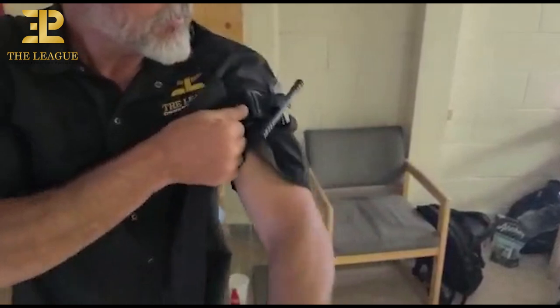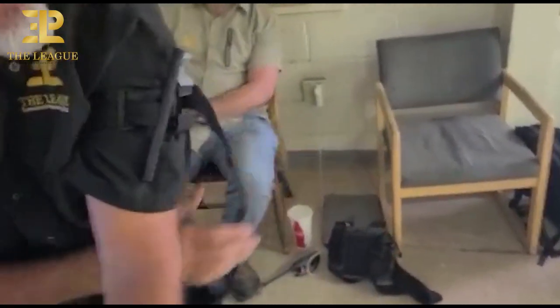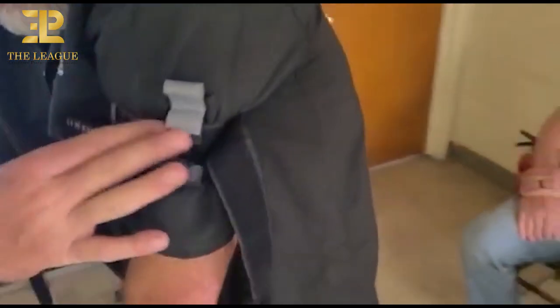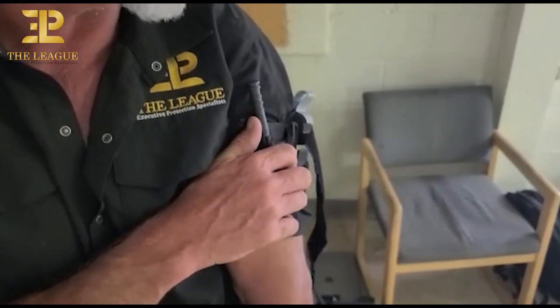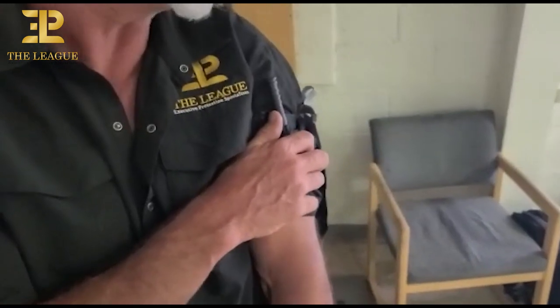Snap. Make this as tight as you can. Now, before you ever touch the windlass — which is the bar — it's generally going to take two and a half to three and a half turns in real life. We're training one to one and a half, whatever you can tolerate on goodwill. But we're going to crank.